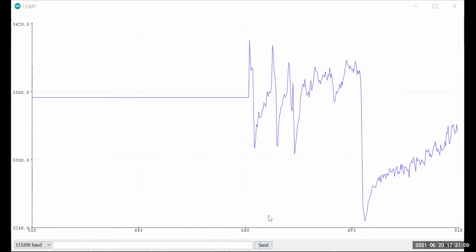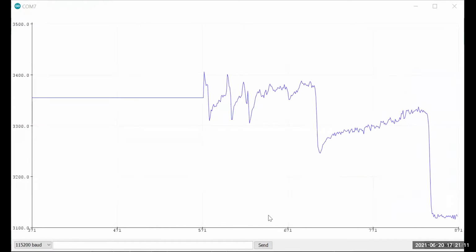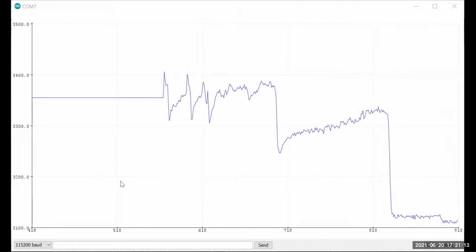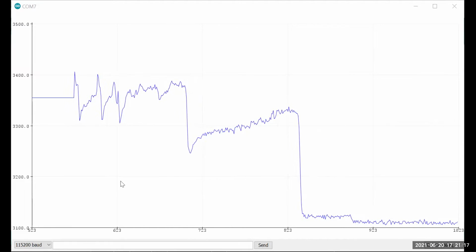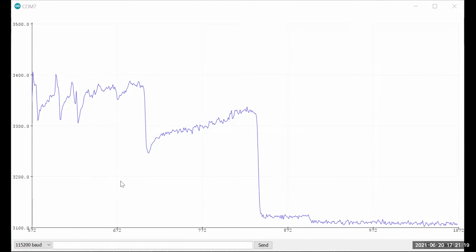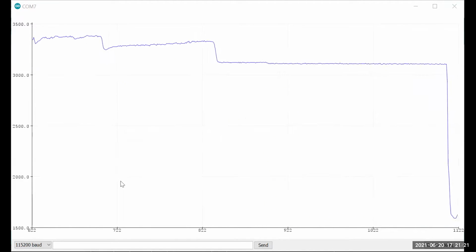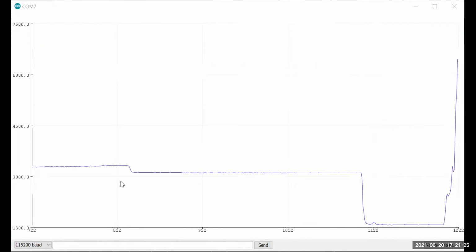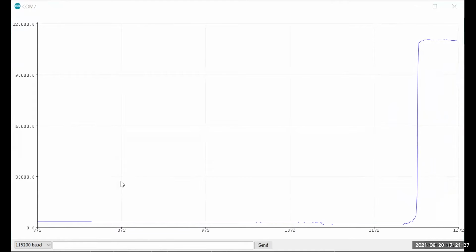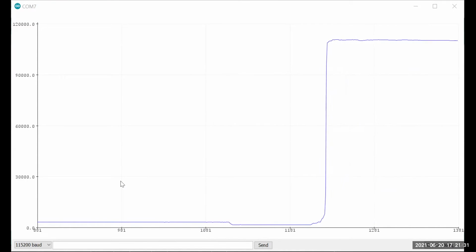It's going to be important because if I don't take 500 samples before the plotter starts, the values will start at 0, then make a measurement. So you're going to have this rapid shift. I'll show you what that looks like. It'll look like this, and notice how you can't see my pulse. Then when I put my finger there, this has to scale up to over, what's that, 100,000 right off the bat.